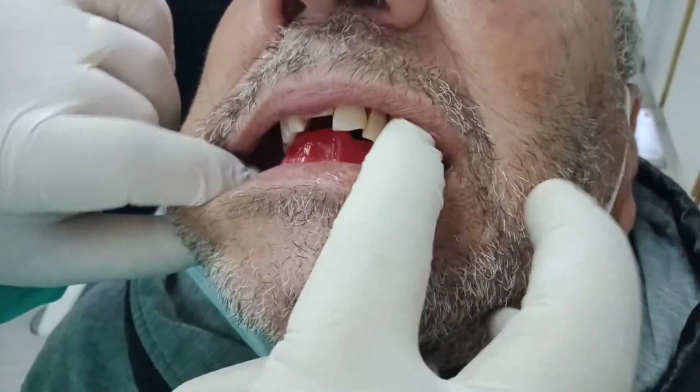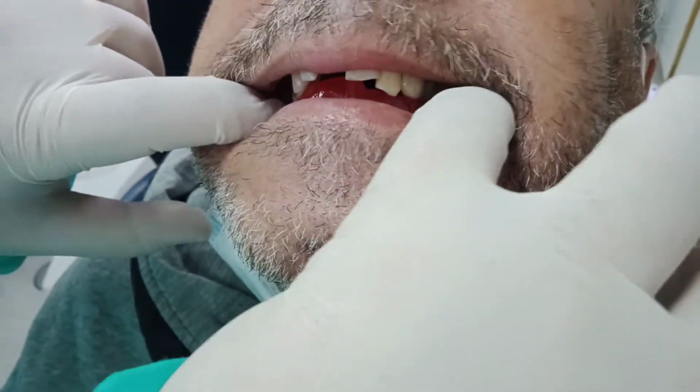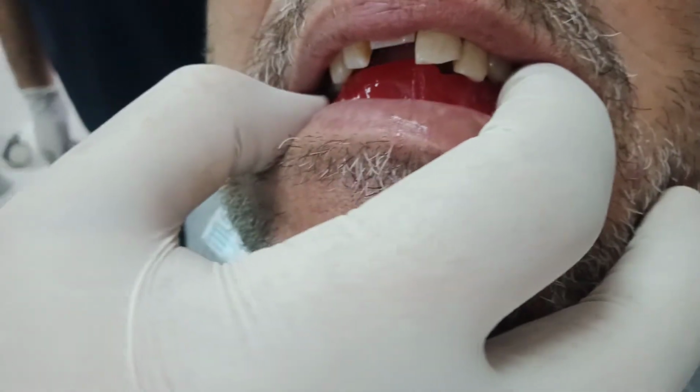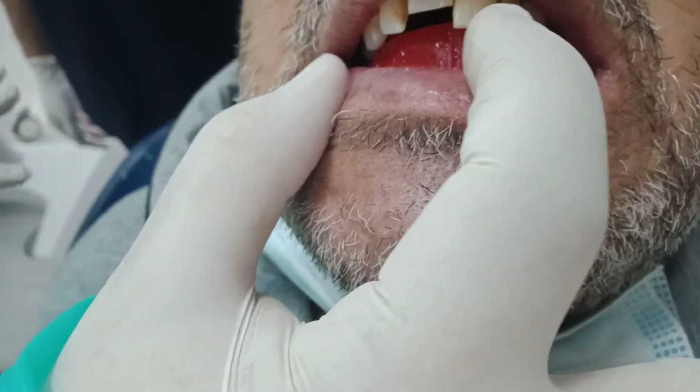These indentations now are avoiding the over-erupted teeth, and we use the posterior teeth as stoppers. Okay, because the occlusion posteriorly is intact. The occlusal table is not interrupted. The interruption happened in the anterior area.